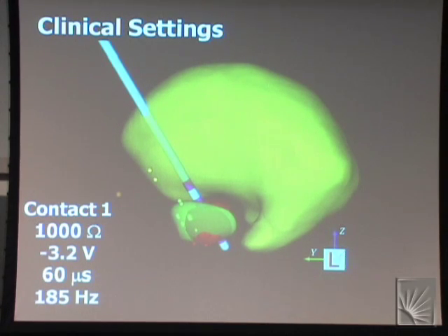This is with their clinical settings. They have deep brain stimulation, which is directly stimulating the subthalamic nucleus, which is, like I said, one of the perceived targets. But unfortunately for this patient, it seems as if their clinical settings have started to spread into these more ventral areas of the STN, and these ventral areas of the STN are known to be related to limbic and associative areas, or these cognitive pathways that also flow through the basal ganglia.